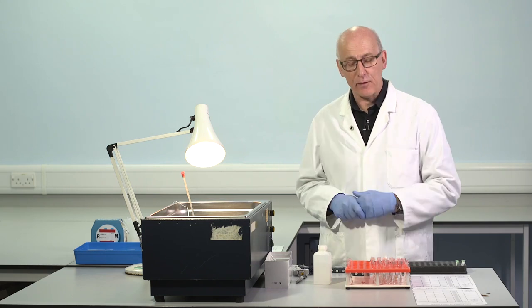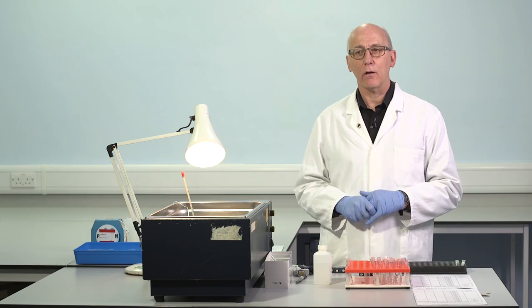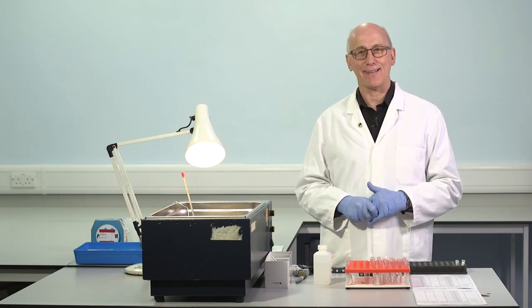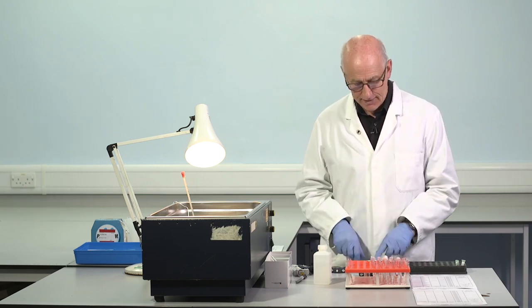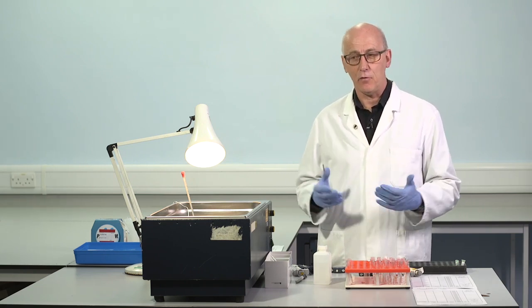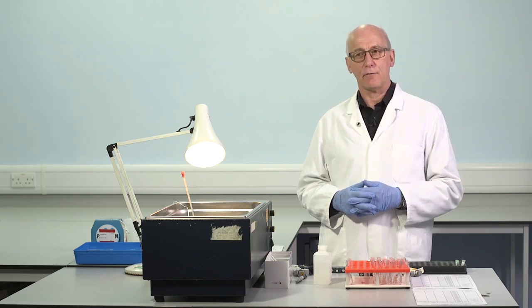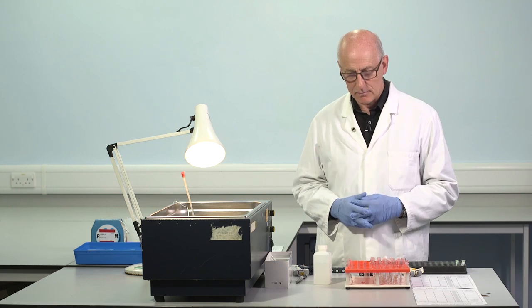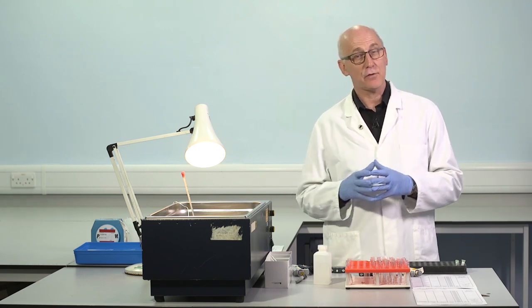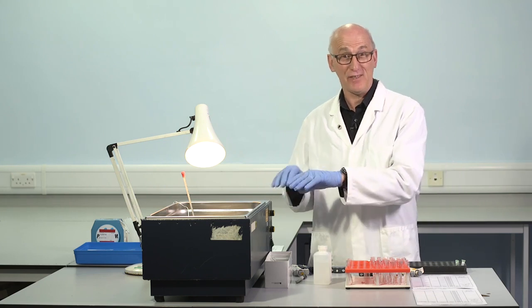Of course, we're performing just now a factor VIII assay. And as you know, there are alternatives to one-stage factor VIII assays. It can be assayed in chromogenic assays, for example. There are a number available. And there are some studies which have looked carefully at the results of factor VIII inhibitor testing to compare use of chromogenic techniques with one-stage assays for determination of residual factor VIII.